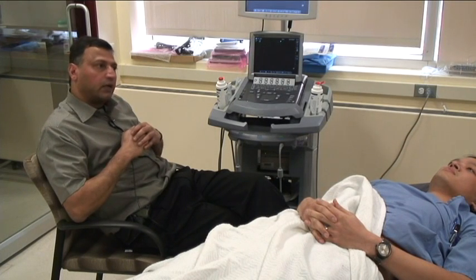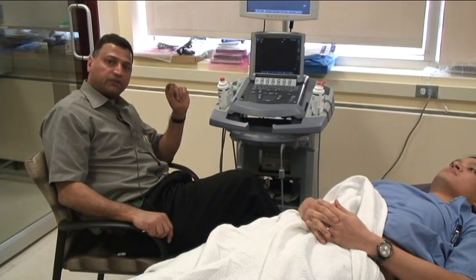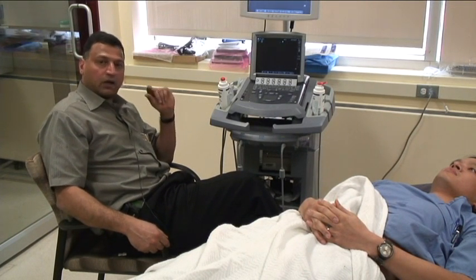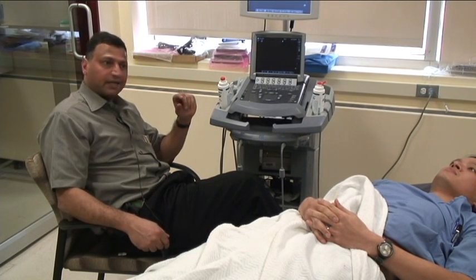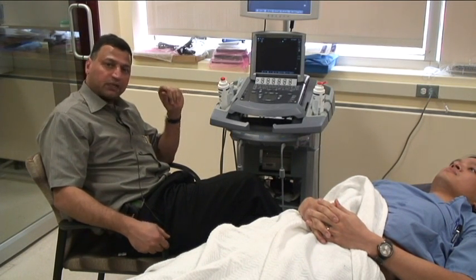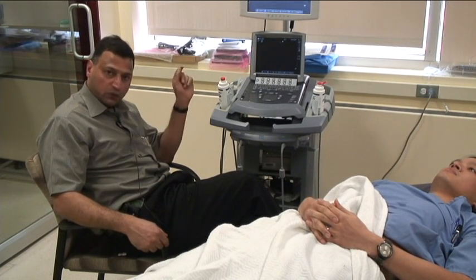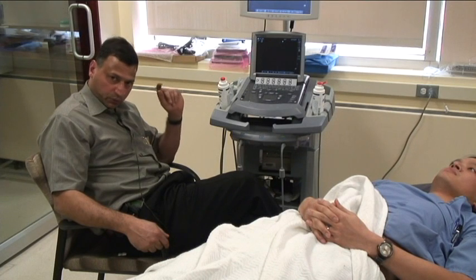If you want a rough estimation, remember, I use the term rough, a rough estimation of CVP with the IVC, it's easy to remember. First, you look at the diameter. If the IVC diameter is less than 2 centimeters, and there's greater than 50% variation in the caliber on respiration, it correlates with a CVP of 5. If it is less than 2 centimeters and there is absence of 50% variation, CVP of 10. If it is greater than 2 centimeters and there's 50% variation with respiration, CVP is likely to be 15. And if it is greater than 2 centimeters and there is no change with respiration, the CVP is likely to be about 20.